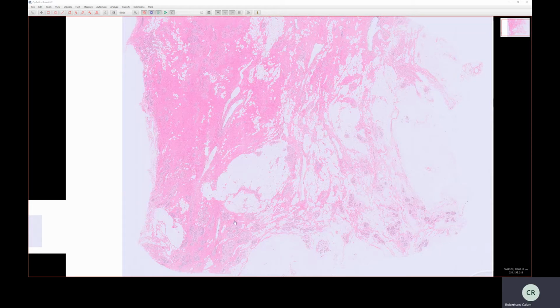are the epithelial elements of the breast, and there are two. So there are these things, which are the ducts, which are the open spaces lined by epithelium, and the round structures, which are the glands, which form lobules.